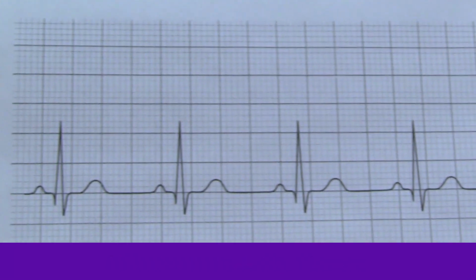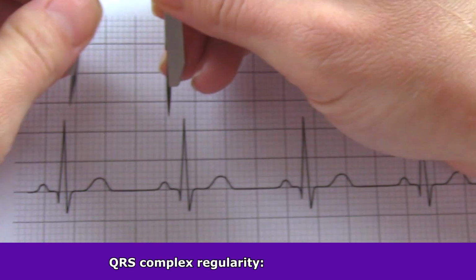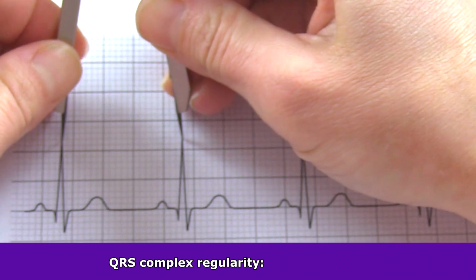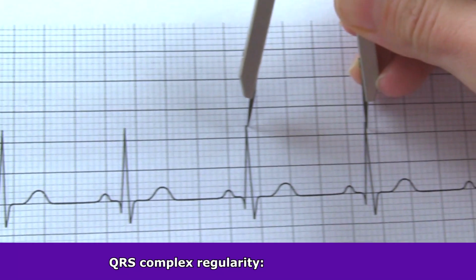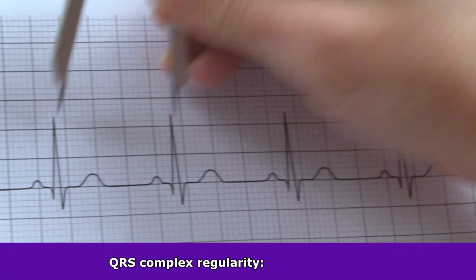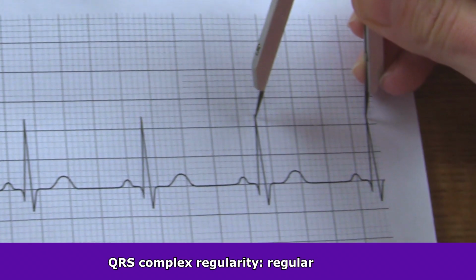Now let's look at the QRS complexes. So first, regularity. Just like with the P waves, we're going to take one end of our calipers, put it on the R wave of the QRS, and then put it on the other R wave of the QRS, and then just track it down through the strip, making sure that they line up together and that they are regular. And so far, they look regular and they are regular.